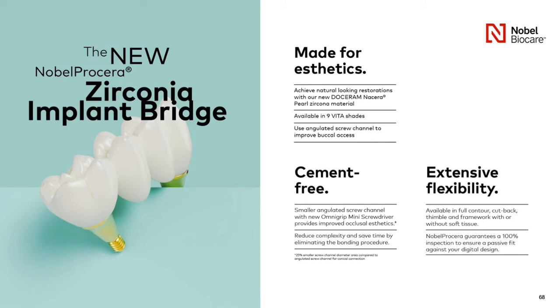The vast majority of these cases in the past were restored with what we call a hybrid, which was a titanium bar wrapped in acrylic with denture teeth processed in it. Like Dr. Reddy said, those are denture teeth. They're going to wear, especially depending what they're opposing. Things are changing.